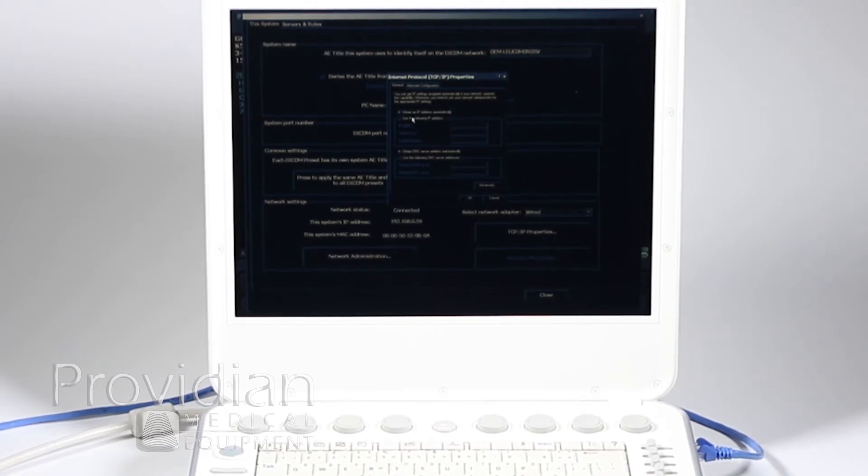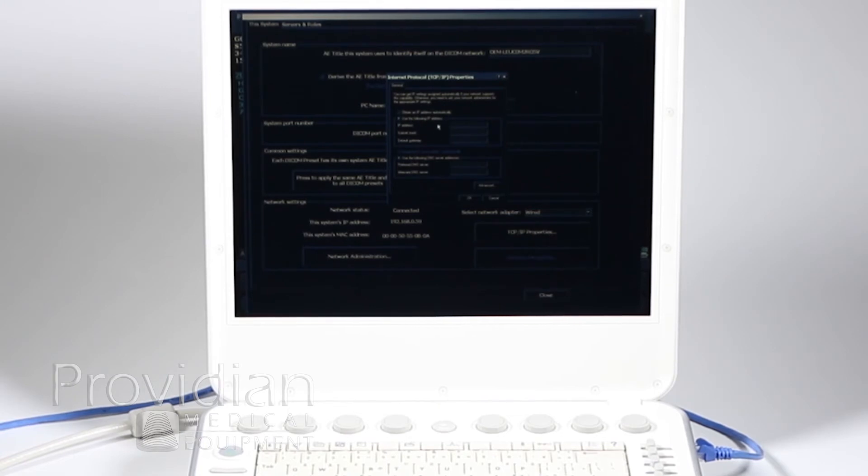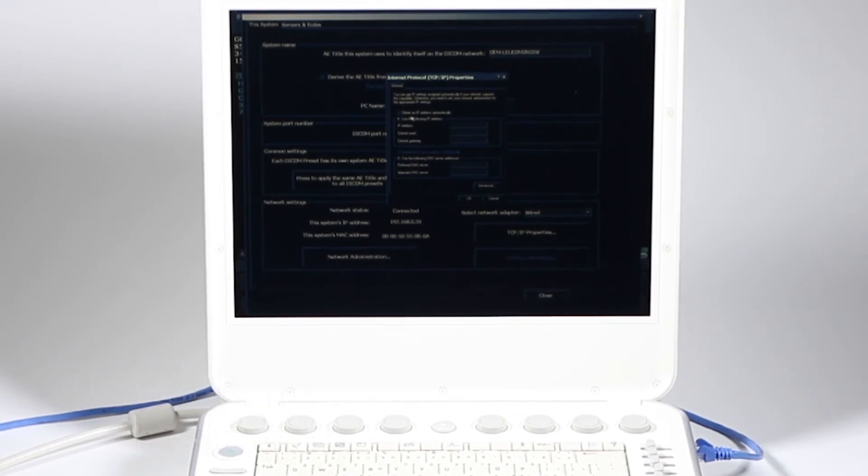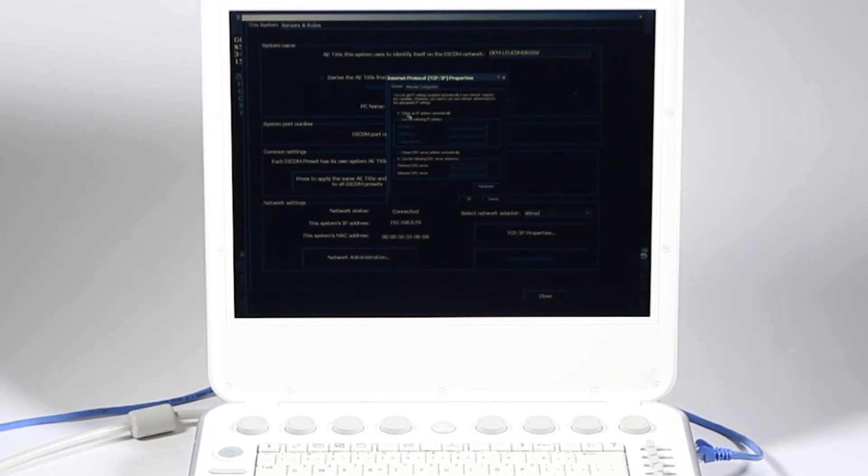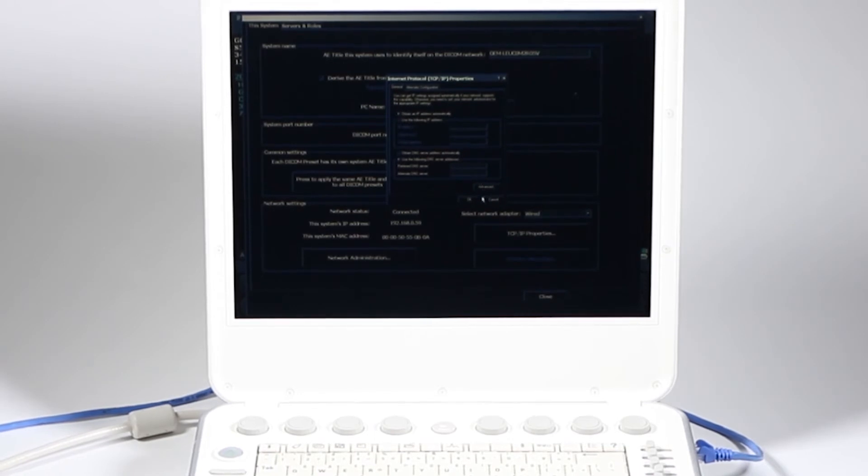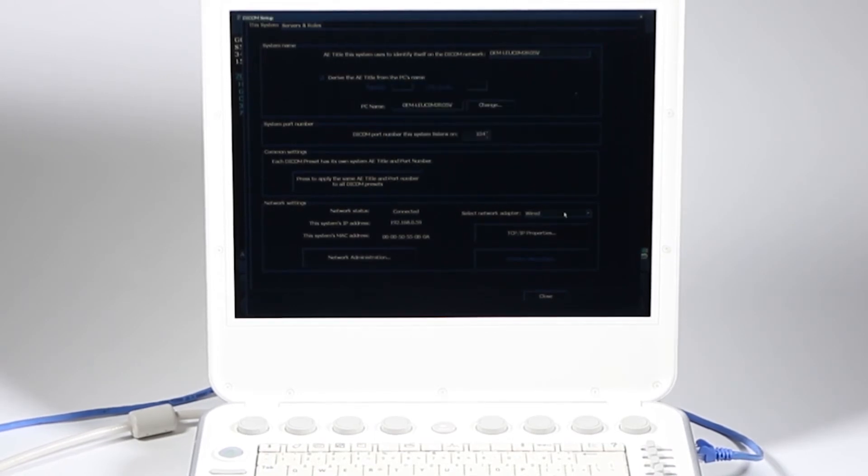If I want to make those changes, I'm going to hit TCP IP properties. This pulls up the Windows box from Microsoft Windows. I chose obtain IP address automatically. This is something called DHCP. If your network was using DHCP, just click obtain IP address automatically and then go ahead and click OK. If they gave you a static IP, that's where you're going to click here and type in all the stuff they gave you before. I'm going to cancel since I'm already set up.